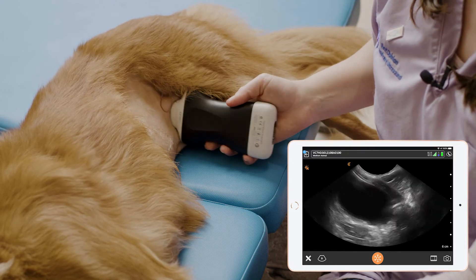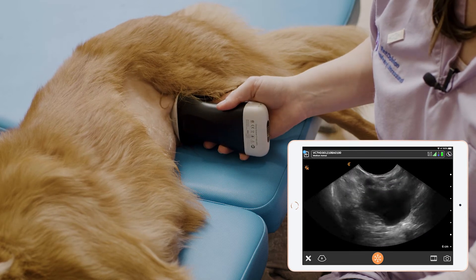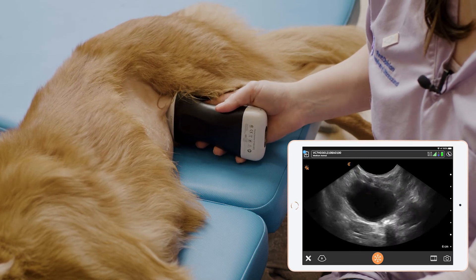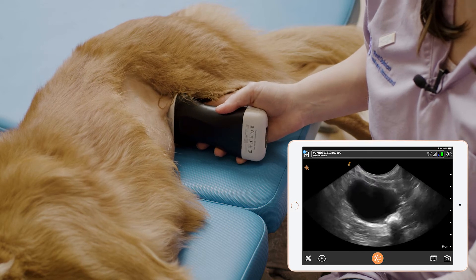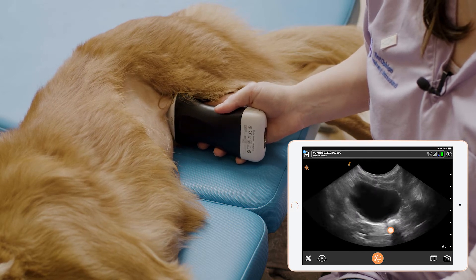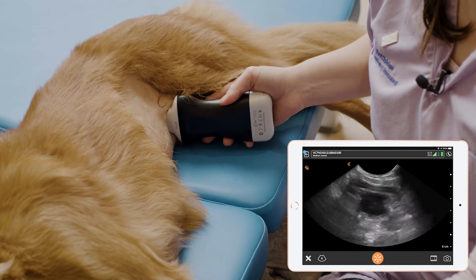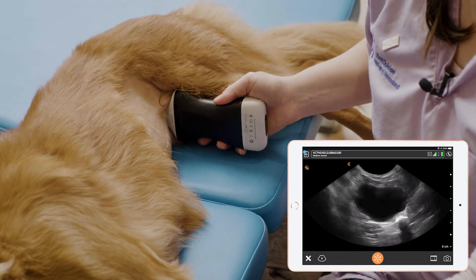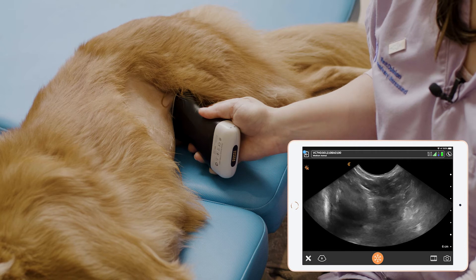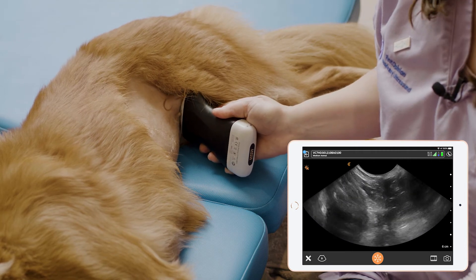Once we've scanned in that plane, we can rotate the probe so we're now getting a transverse view. We're also getting a transverse view of the colon beyond the bladder, and again we can fan all the way cranially and all the way caudally. In a male dog, this is where we'll find the prostate.